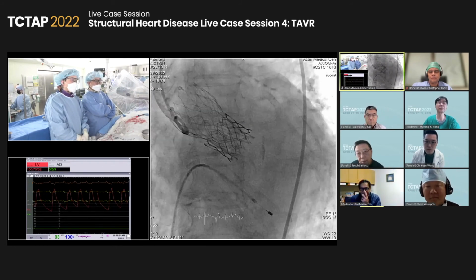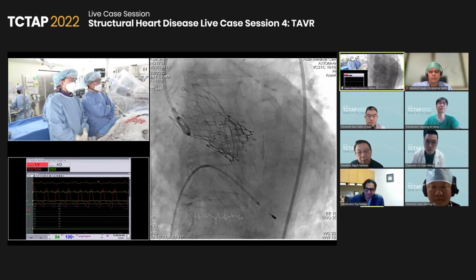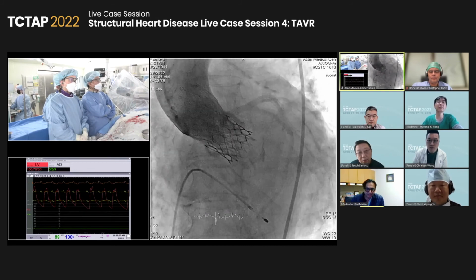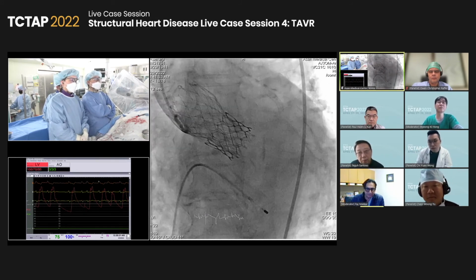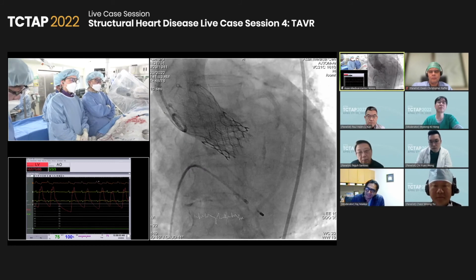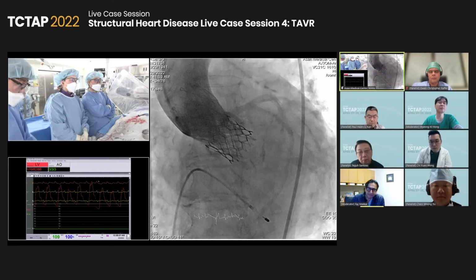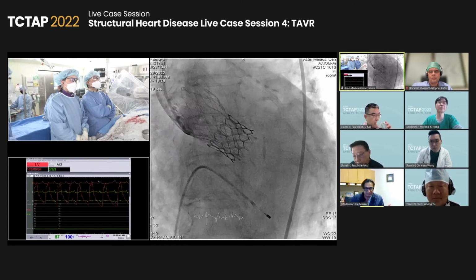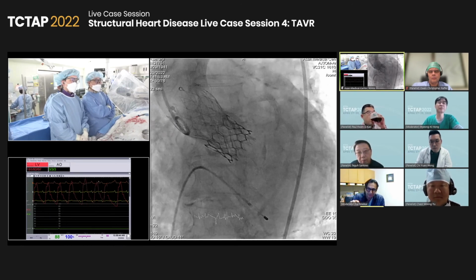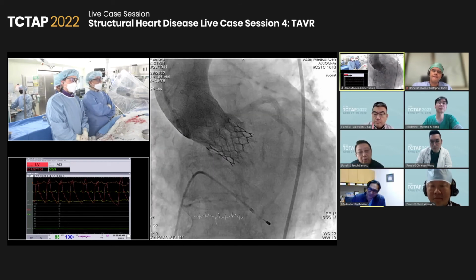So I think we have the recent trial with edoxaban, which favors using that, or you can go ahead and use warfarin if that was not the case the first time around. And I think I would monitor the gradients of this patient. This is in the absence of any data, right? But I think we are treating, this is precision individualized medicine for this particular patient. So I think I would do that.